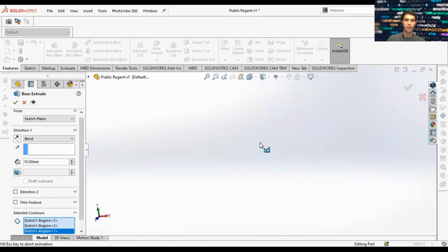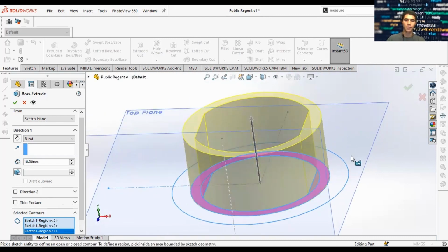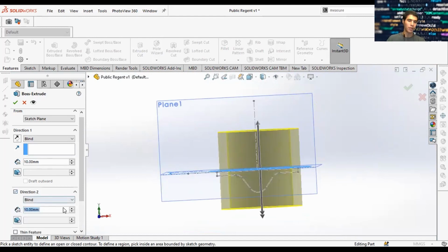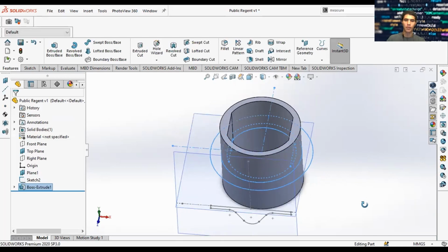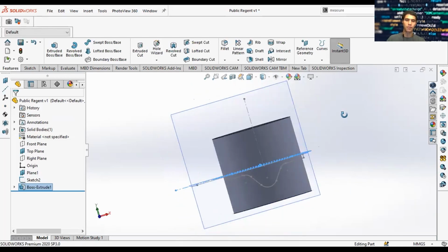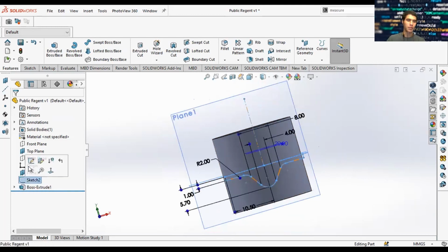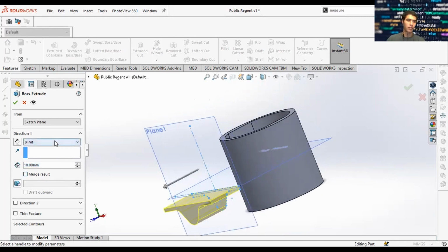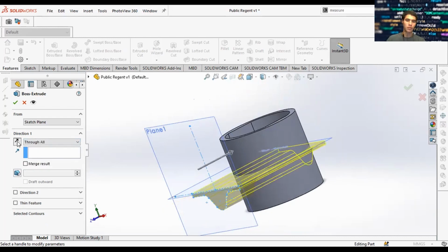This is what I want to select right here. And I want to select it, extrude on both sides. And right now what I have is a cylinder looking thing. I go back to my sketch 2 and extrude that. So I want to unclick here, merge result, unclick that, and all you just got to do is extrude through all.